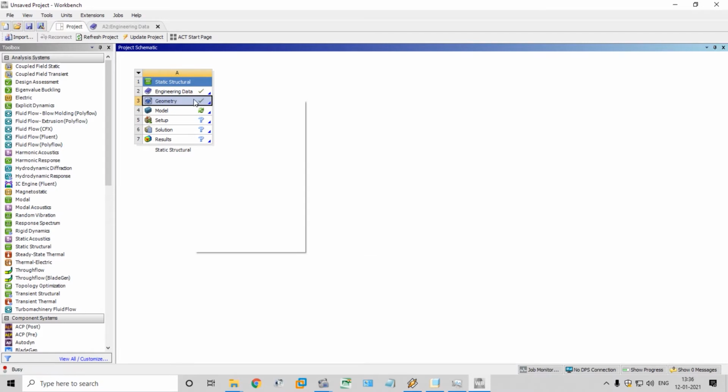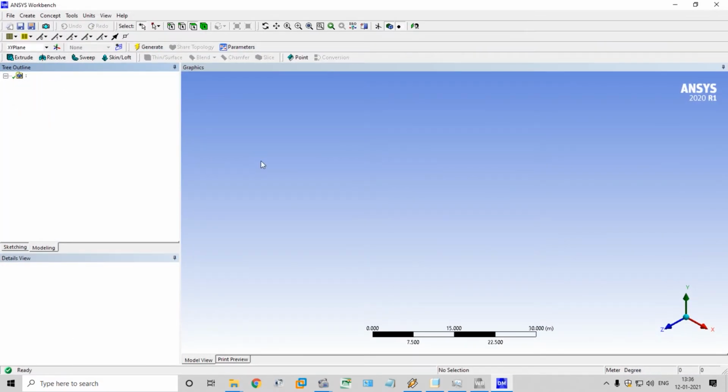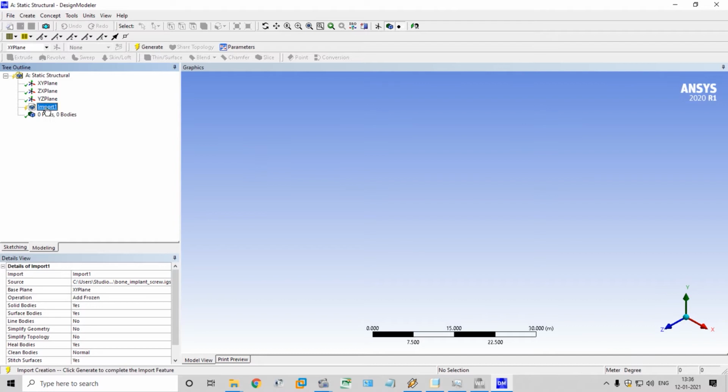Then right click on this, edit in the design modeler. It will take you to a separate application, design modeler in ANSYS Workbench. It is opening. Okay, opened. Import one. You can rename it as bone, implant and screw. Then click generate.